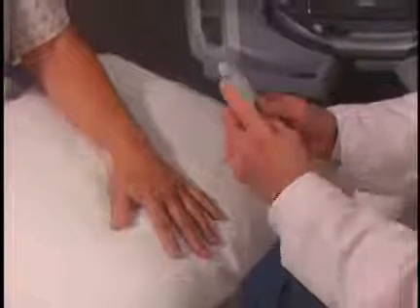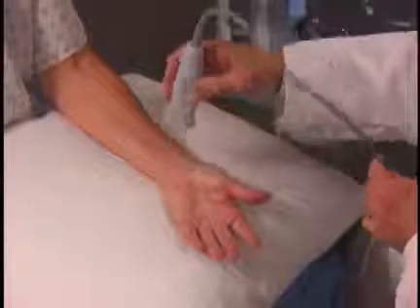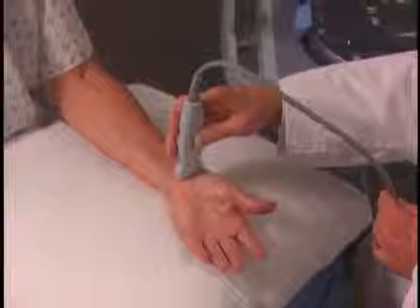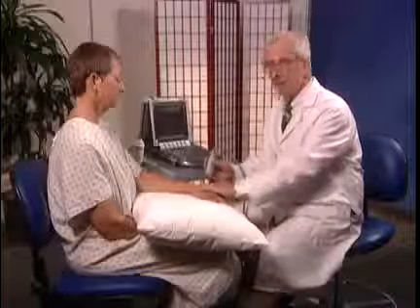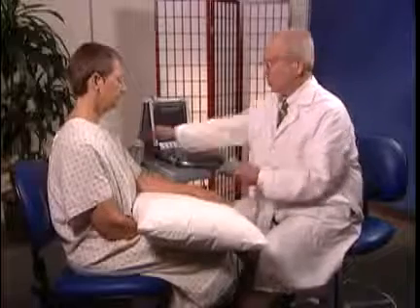We're doing an MSK type of exam. For orientation, there is a marker here which corresponds to the turquoise dot on the screen. Keep this marker proximal when I'm examining longitudinally and medial when I'm examining transversely. And we'll start the wrist on the dorsal surface and examine transversely first.